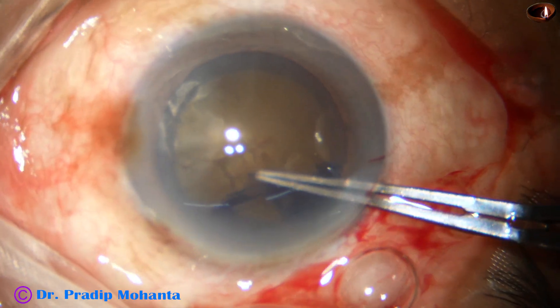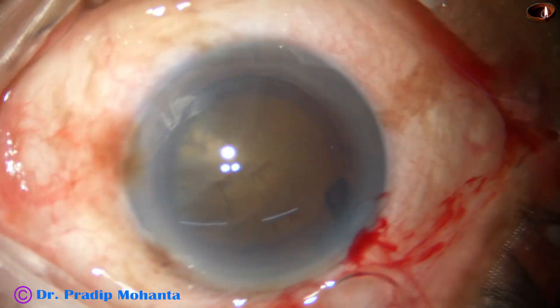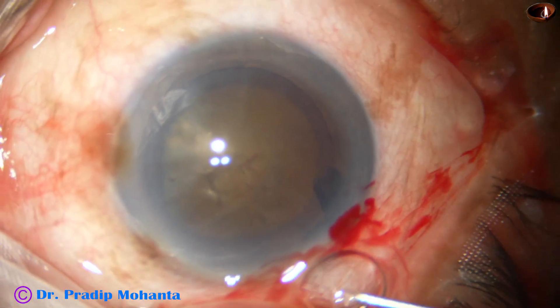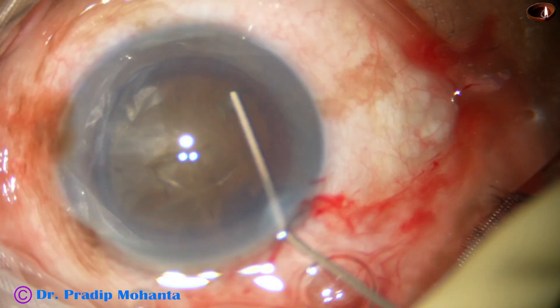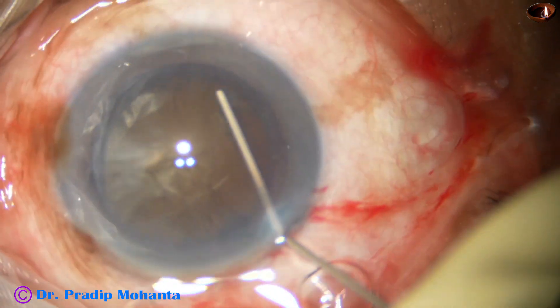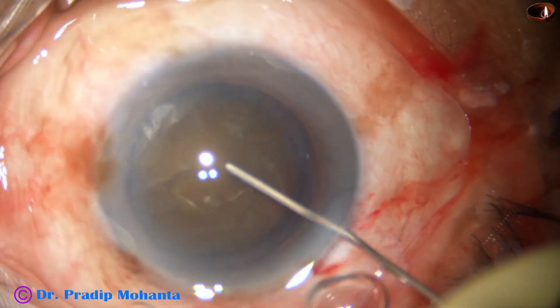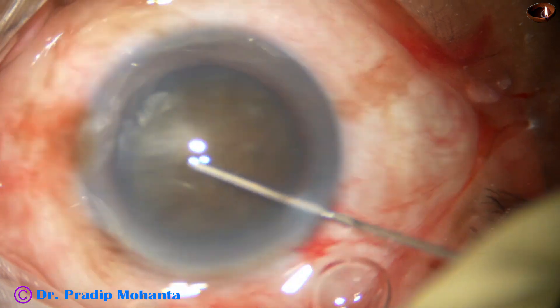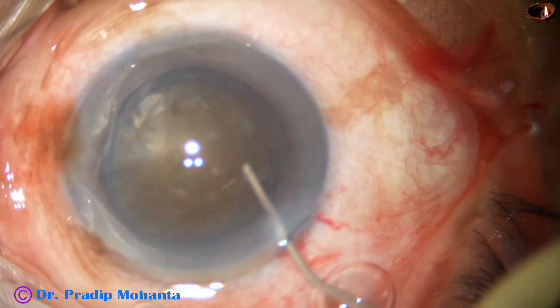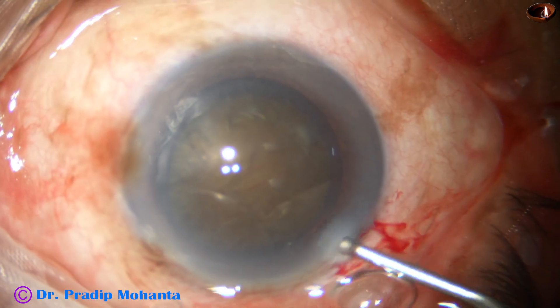It is done and now hydrodissection. We cannot see the fluid wave in such dense cataracts, so small aliquots of BSS are injected at multiple points. What happens is the nucleus just comes up, comes anteriorly — you just have to tap the nucleus and mobilize it.